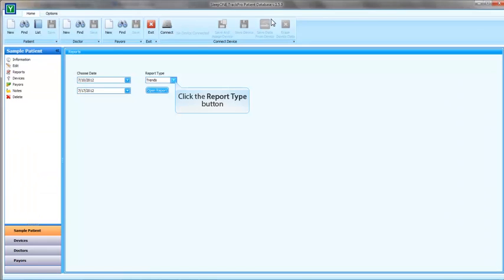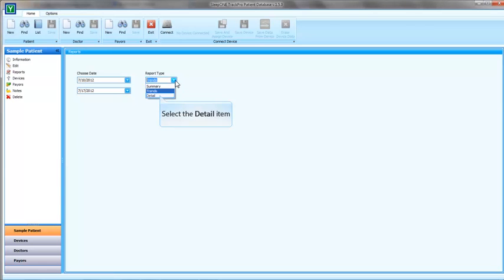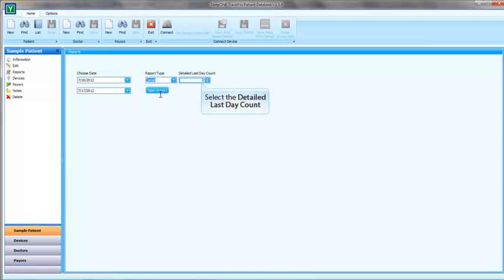Now let's have a look at the most comprehensive report, Detailed patient report. Detailed patient report covers summary and trend reports. It adds daily detailed reports to them. When you select Detailed report, there will be an additional selection for how many days you want the daily details to be added. So for example, if you want you can select a 1 month timeframe for the report dates but then you can only ask for the last 3 days as detailed data.